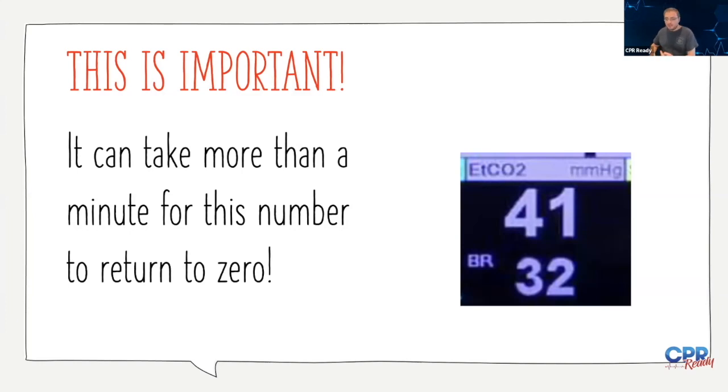In order to calculate that and make it meaningful to you, I think the Zoll monitors look at the last 7 or 8 breaths. This is about a minute lag, depending on where you catch it in the cycle. So if you're just watching this number on your monitor, this end-tidal CO2, you're not getting absolutely real-time information that's breath to breath. And this number can take a while to change when the patient's condition changes.